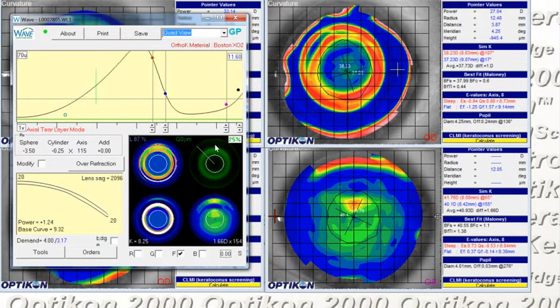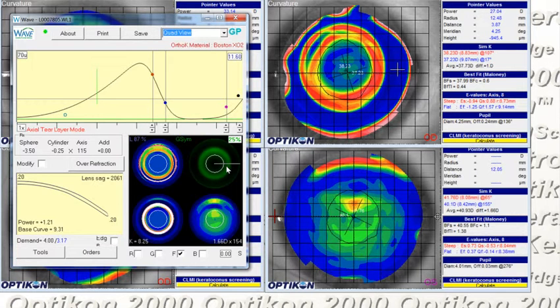And now we're pretty close to one and a quarter in all the meridians. We still have a lens that fits a little bit loose in the vertical and is larger with a larger OZ and IC. This should give us a larger treatment zone and hopefully, along with a little bit less correction of the astigmatism on the cornea, take care of the glare that the patient is noticing.